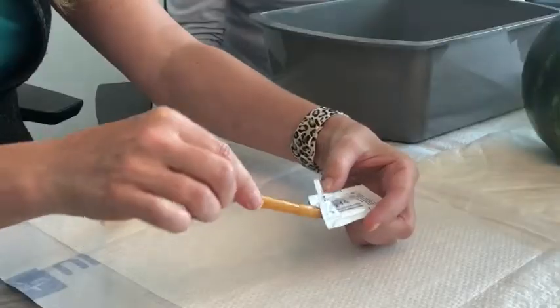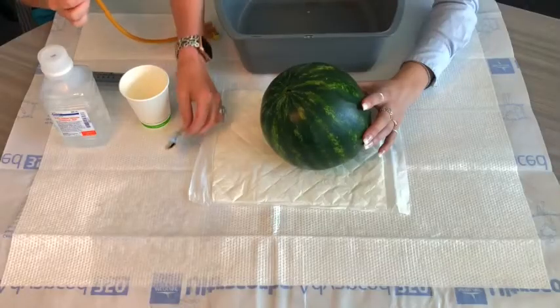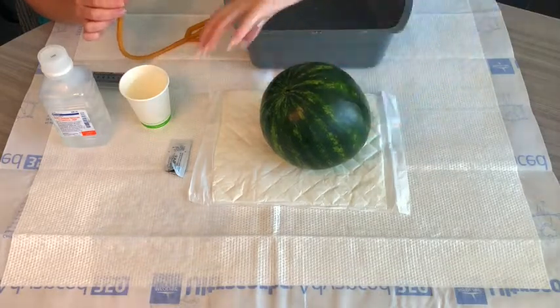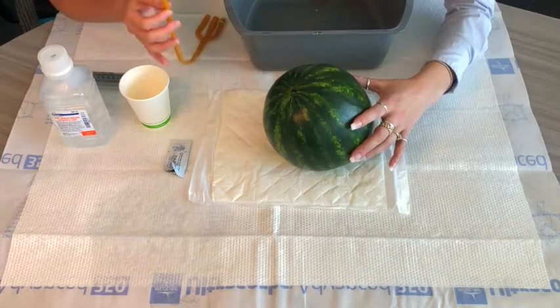Take your catheter and lubricate the end of the tip. Next, lift your watermelon baby's legs to get them in a good position. Two good positions are either on the back or on their side with their knees up to their chest.